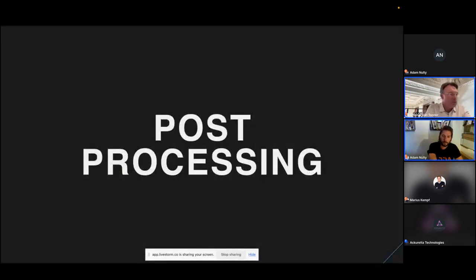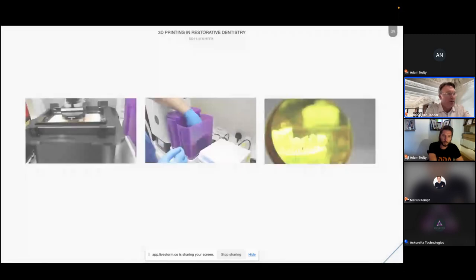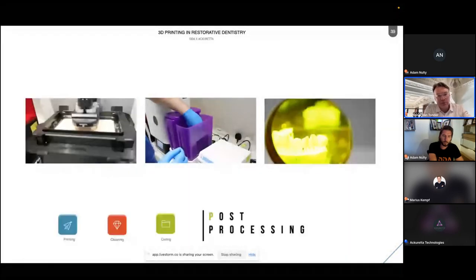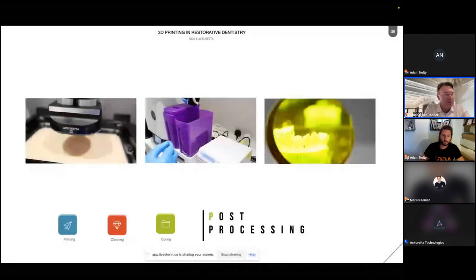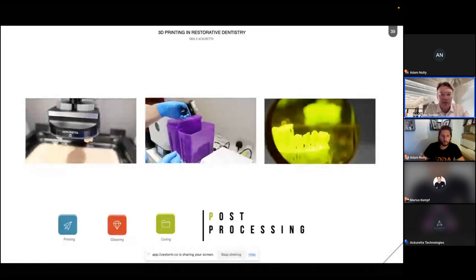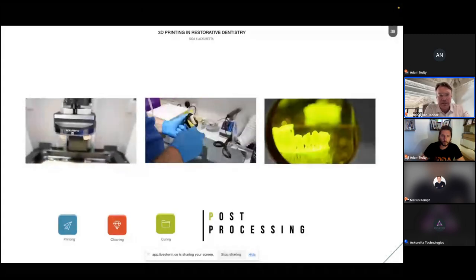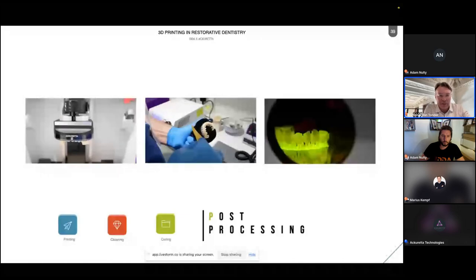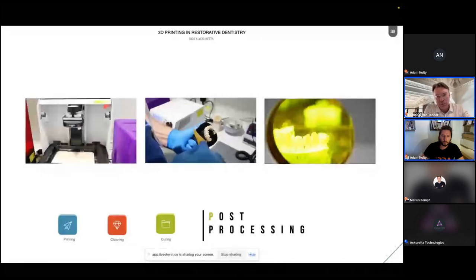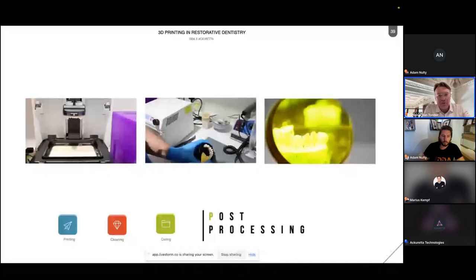Yeah, so post-processing, like we were saying earlier, is a really important part. You have basically three steps in your 3D printing route to get a restoration made. First you've got your printing, then your cleaning, and then your post-curing. Now, the printing is the easy part. The cleaning and the curing is the more difficult part because you don't always have complete vision of what's happening there.